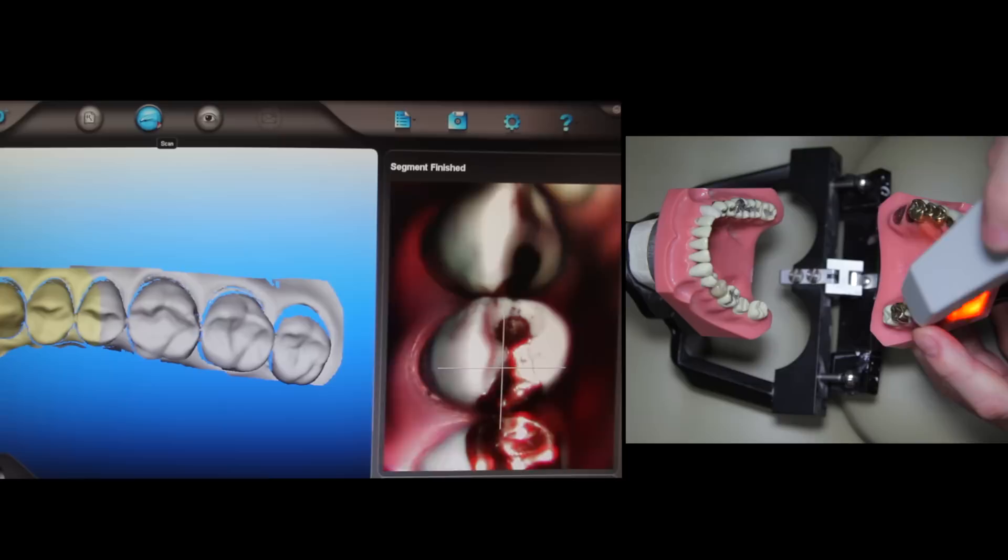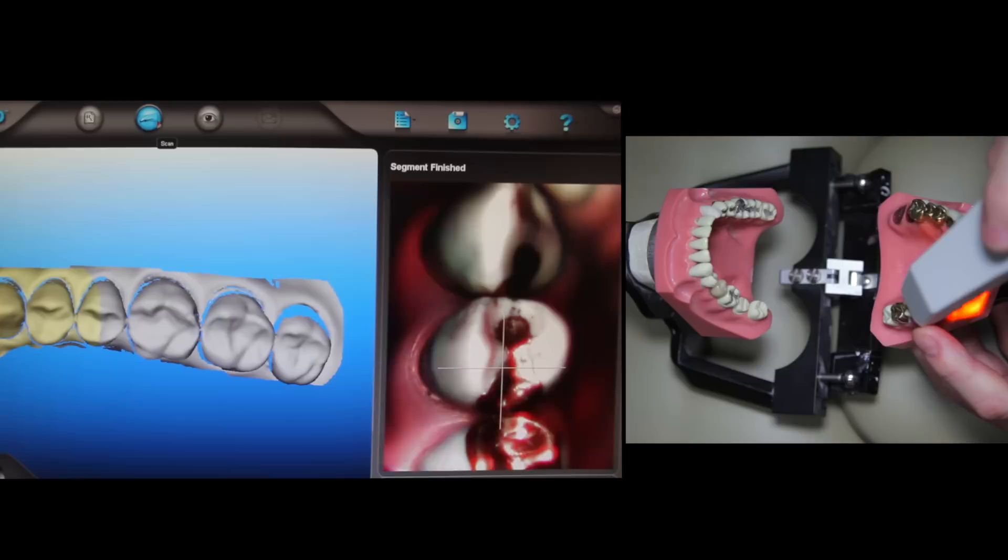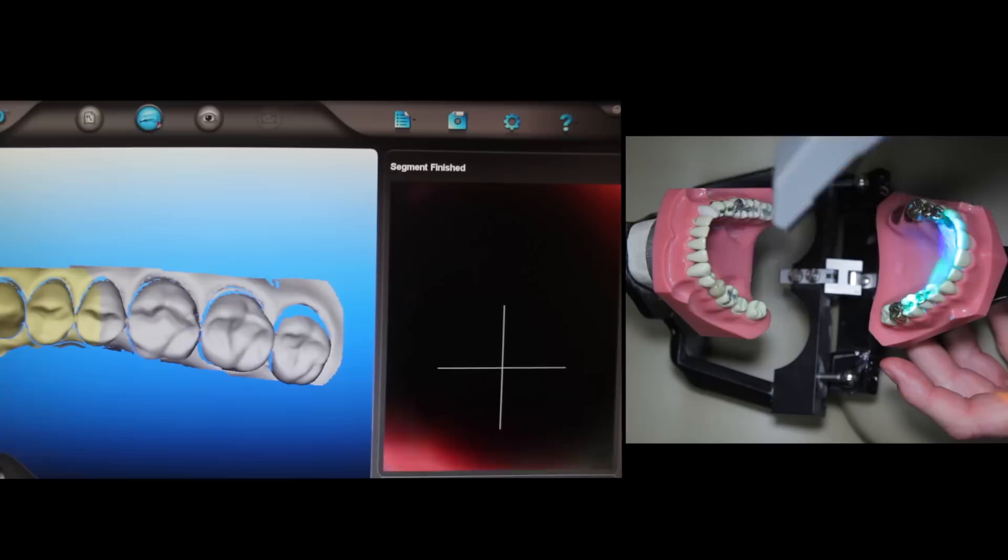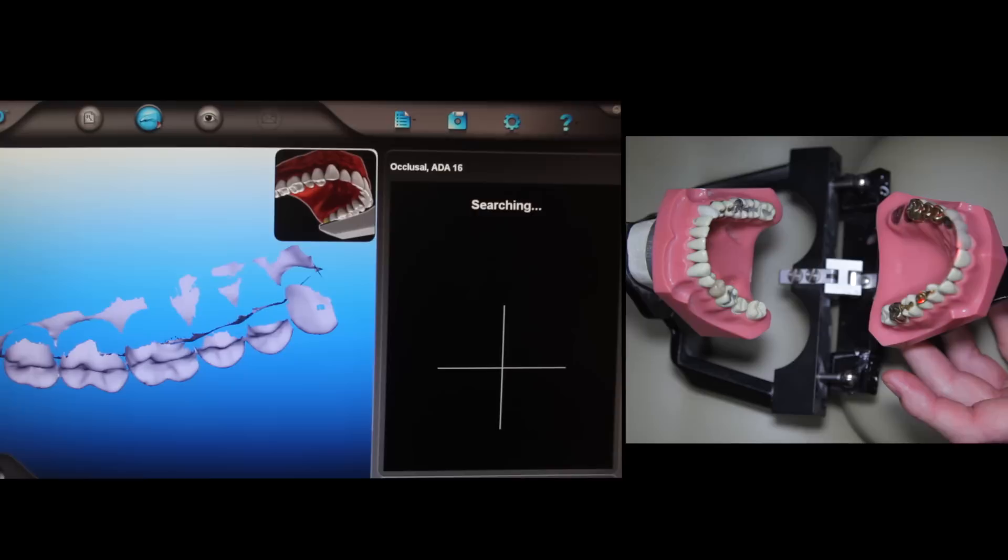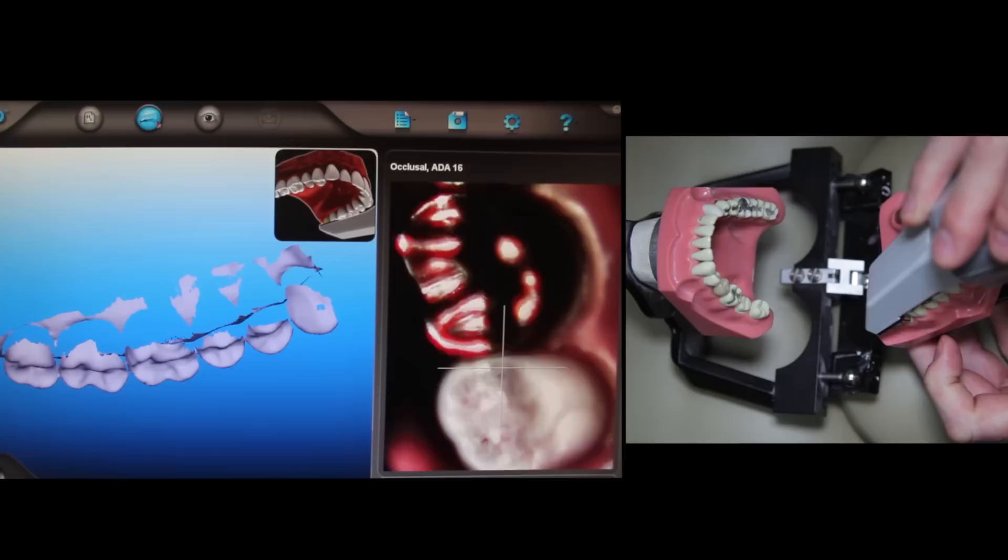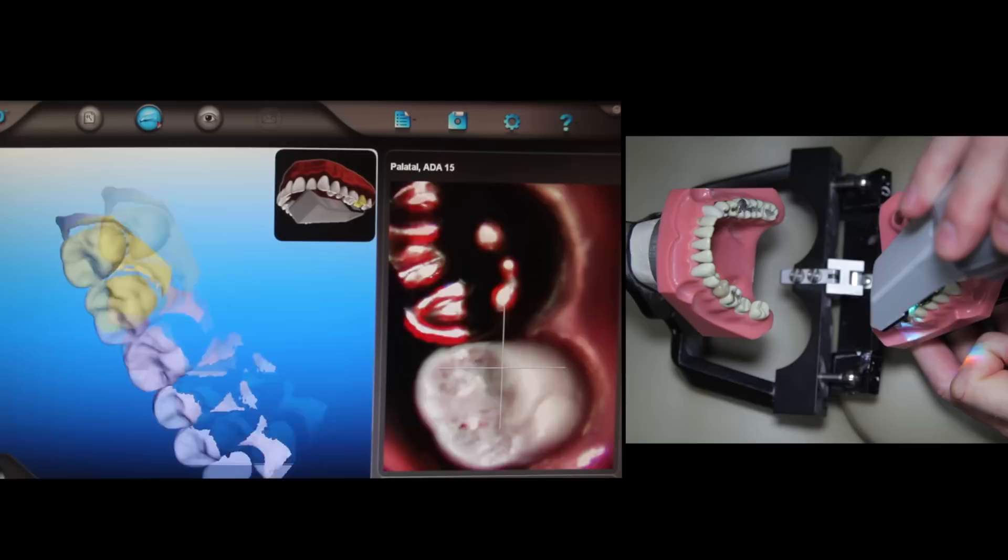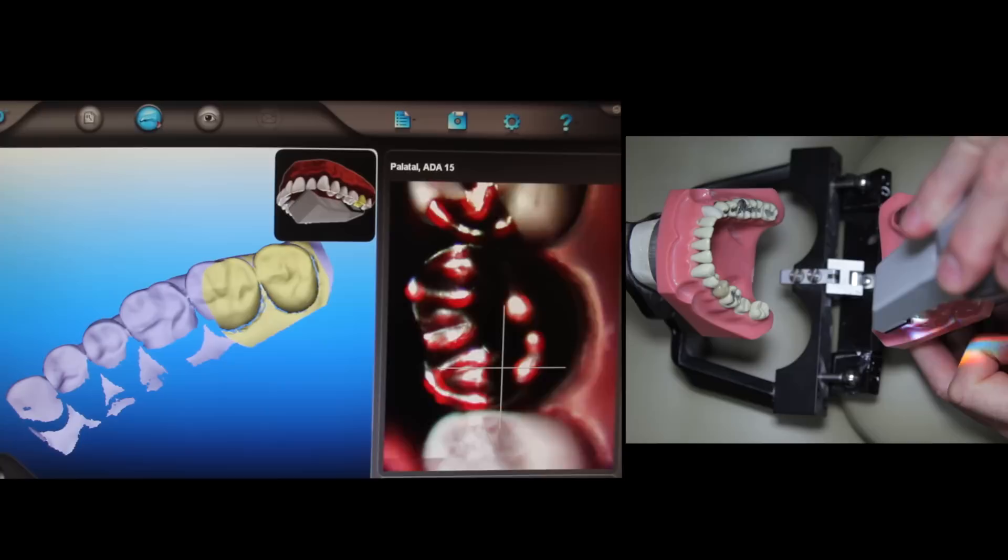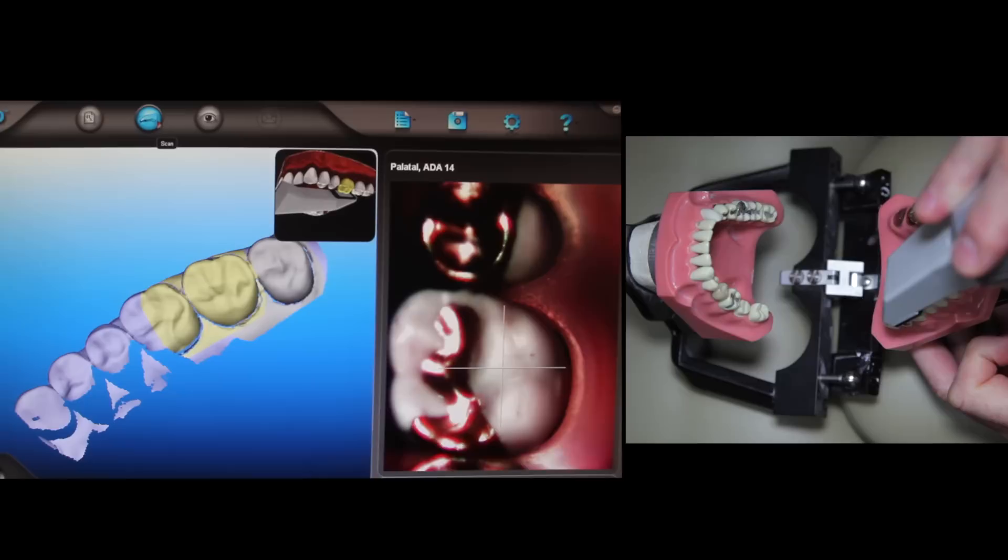So since we're doing one crown, it only takes the scans of this one side. And so you can look back on the screen and you can see that everything looks complete and pretty filled in. So then we start back on the other side of those teeth. Try to keep the teeth lined up in the crosshairs, but even if you don't perfectly do it, it's still smart enough to figure that out.